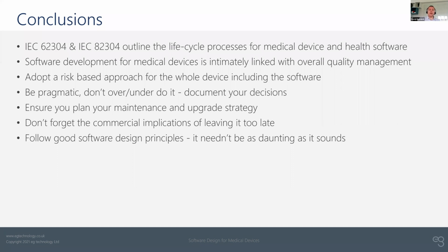and the software development process adopts, as does the whole medical device development process, a risk-based approach. But be pragmatic. Don't overdo it or underdo it. The exercise of documenting your decisions is a really good discipline to go through, because it forces you to be explicit about the approach that you're taking.